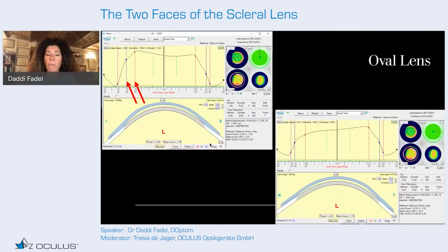So how to do oval lenses with the software provided by the Pentacam? By moving the red and blue lines, you may reduce the corneal zone diameter and the limbal zone diameter. In all the lens, if you notice that it's too much limbal clearance, or if you want it oval, you may change it in the different meridians.